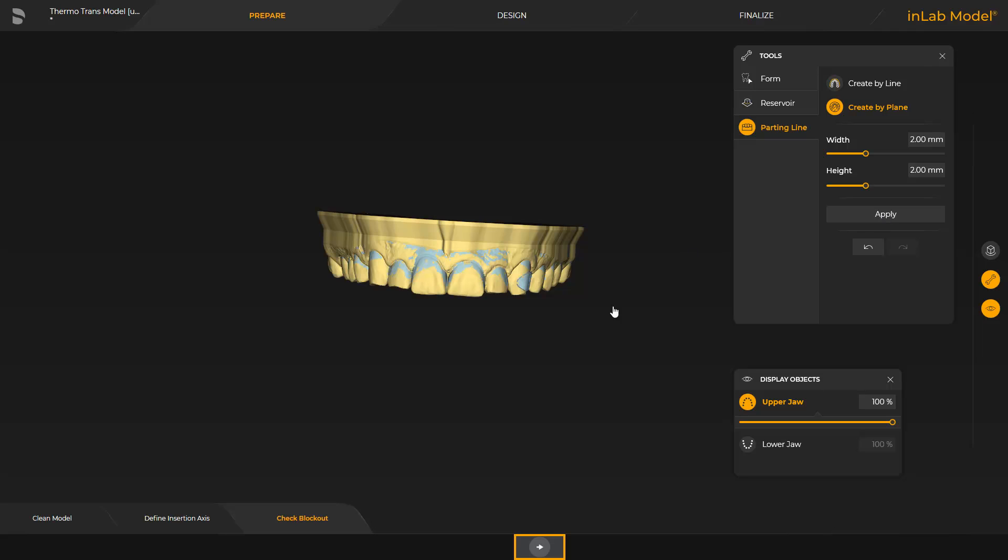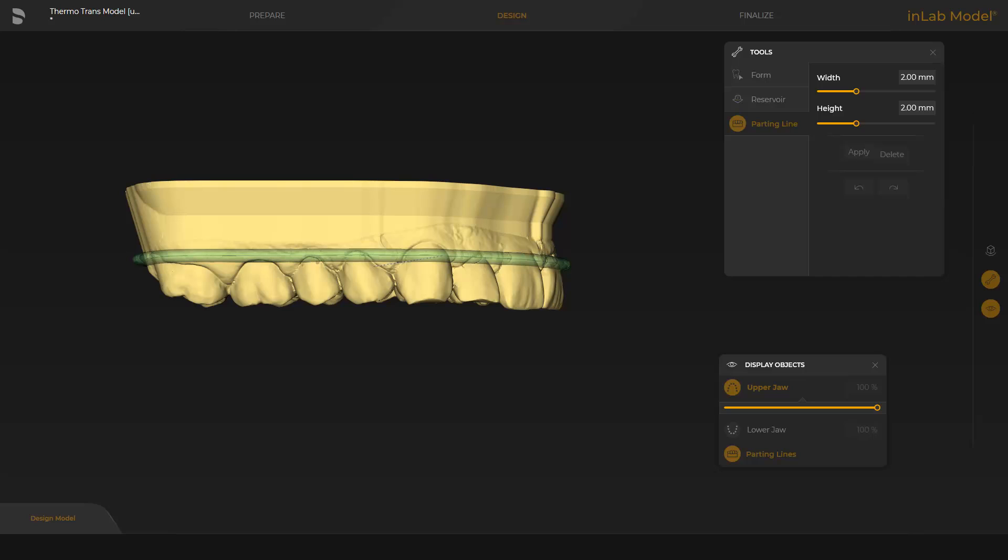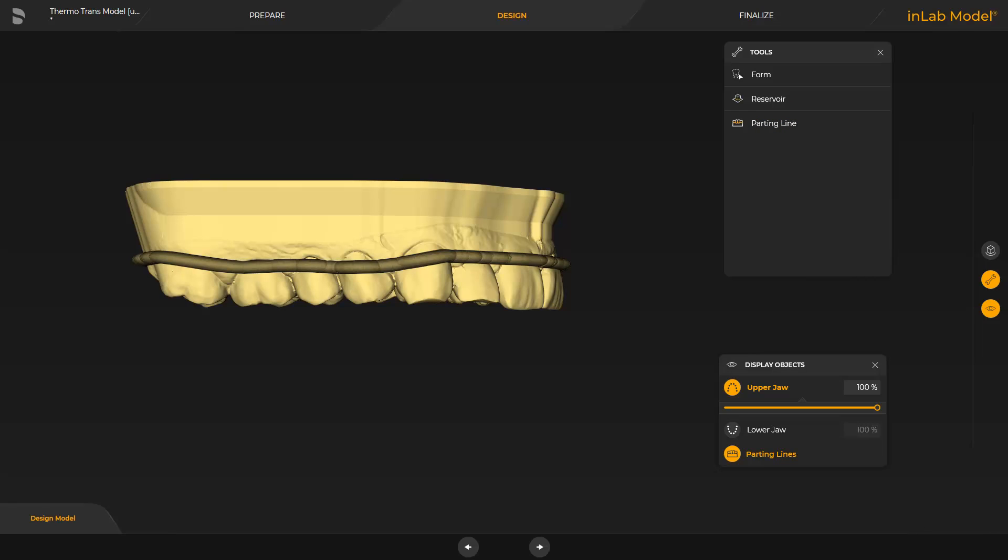By switching to the Design phase, the parting line is displayed. As in the previous step, the same three tools are available here again. We will only focus on the third tool once more. This allows modifying the parting line again. We tap the left mouse button on the line so that it is displayed in green, start with a double click, keep placing single clicks if needed, and finish with a double click. By tapping the user interface outside the model area, the tool and parting line are automatically disabled.